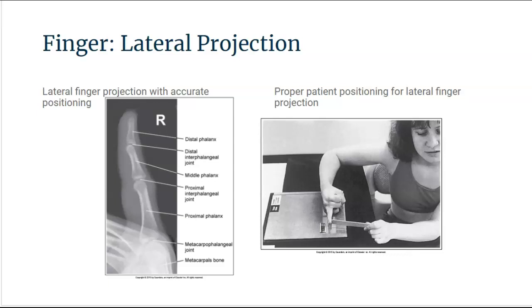The phalanges should not be foreshortened, the proximal interphalangeal joint is at the center of the exposure field, and the entire finger and metacarpal head are included within the exposure field.